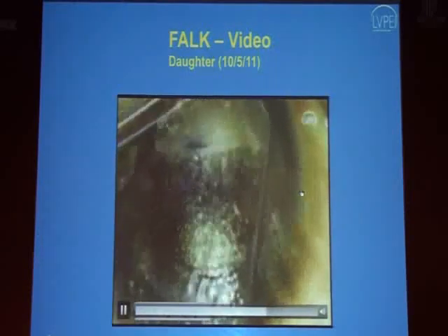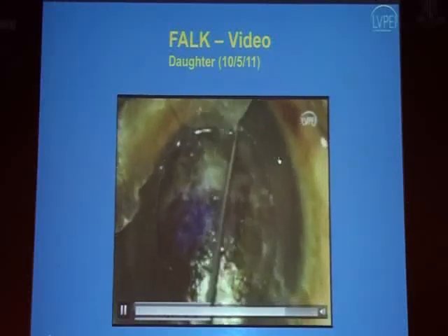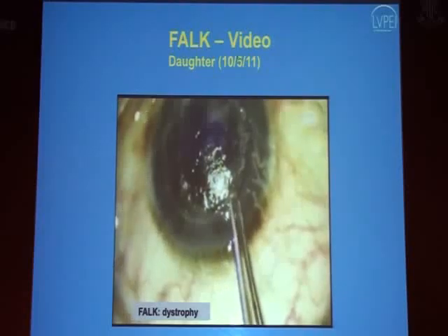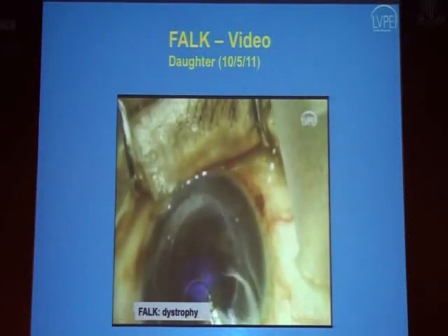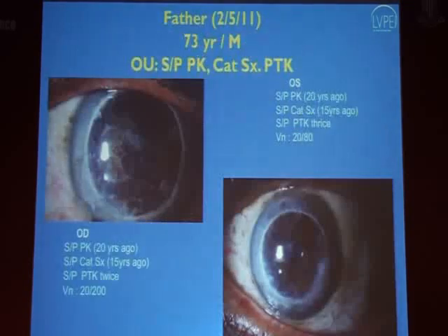And this is in the recipient. There are some bridges or some adhesions because the recipient cornea is not very clear, but it's easy enough to dissect that cornea, and you can just place this thin sliver of corneal tissue down in place, pat it dry, and you don't need glue or sutures. A bandage contact lens is applied, and you wait for 5 minutes, and then this is done. So the technique is extremely simple and very reproducible.